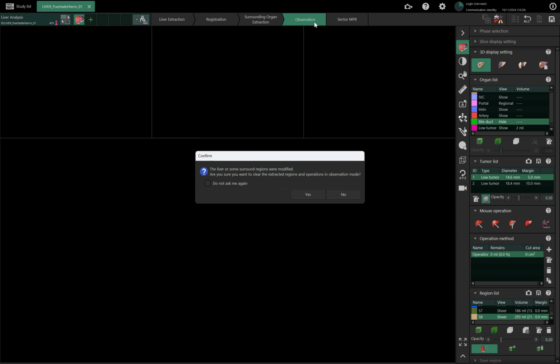More questions, please. Occasionally, they only have MR liver. They do not have CT. Because we don't have MR liver analysis to check the spread of disease, how do you do that?